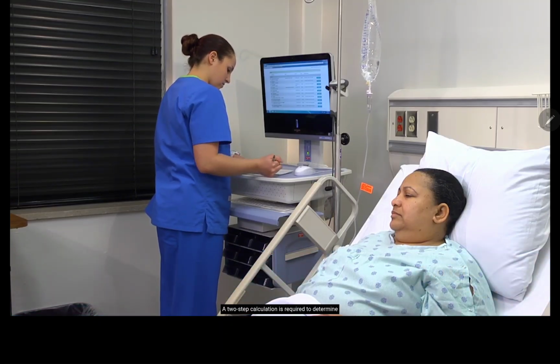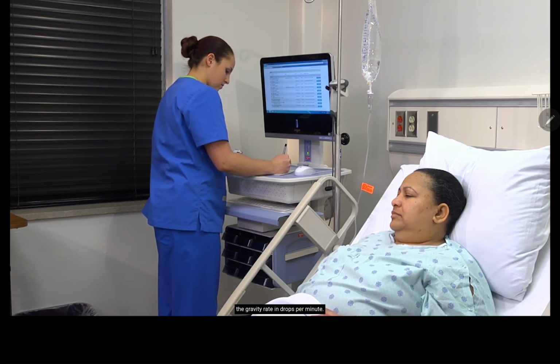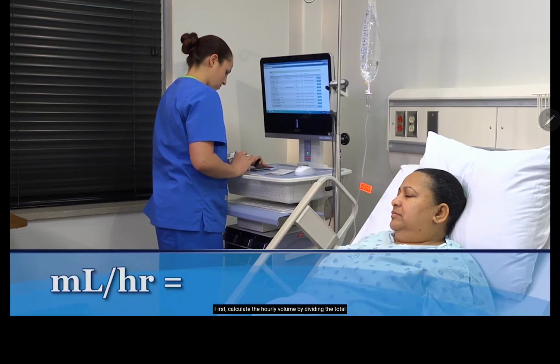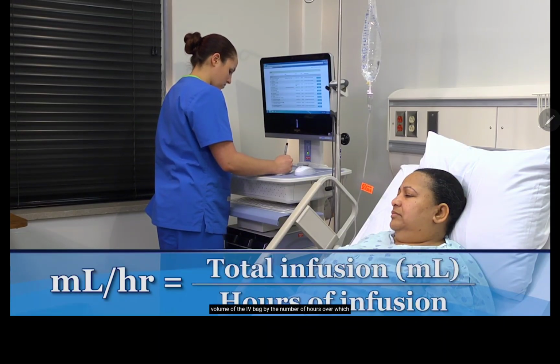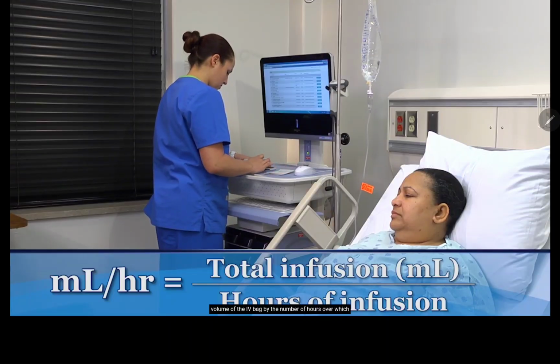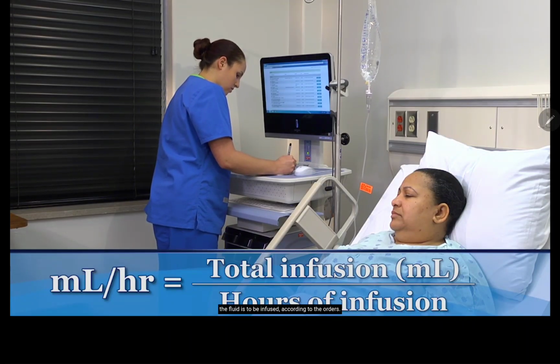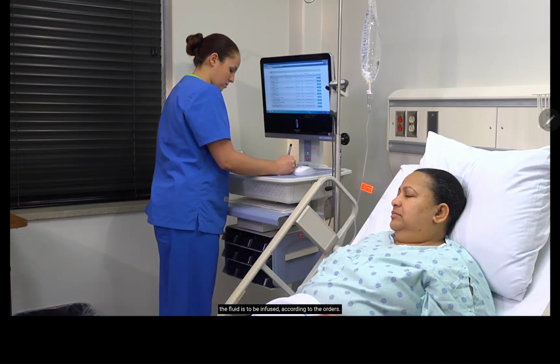A two-step calculation is required to determine the gravity rate in drops per minute. First, calculate the hourly volume by dividing the total volume of the IV bag by the number of hours over which the fluid is to be infused, according to the orders.